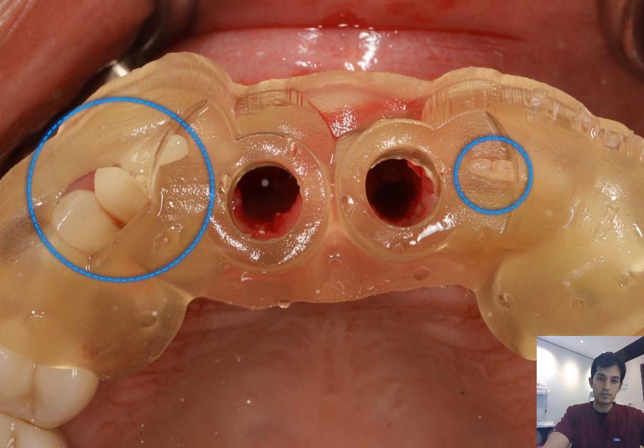I've got my own 3D printer, and you just print this, trim any sharp edges, and your guide is ready. You don't have to cement any metal sleeves in there, and it takes away one bit of error, because there's usually a tolerance between the sleeve and the guide to allow that sleeve to go in. It's just the nature of what it is. In this case, you're working directly with the guide as it is.